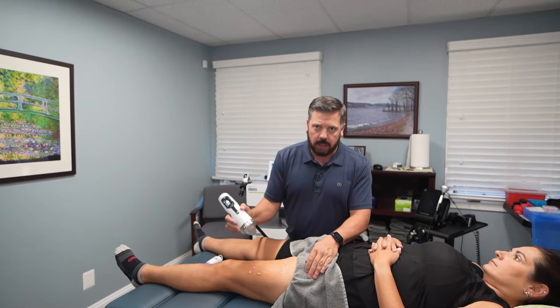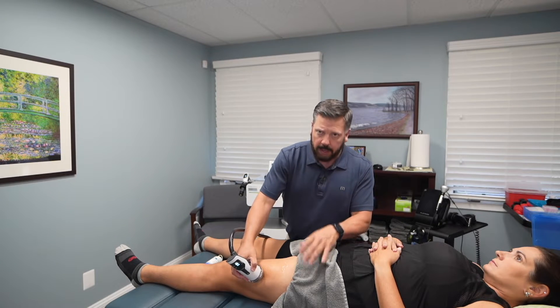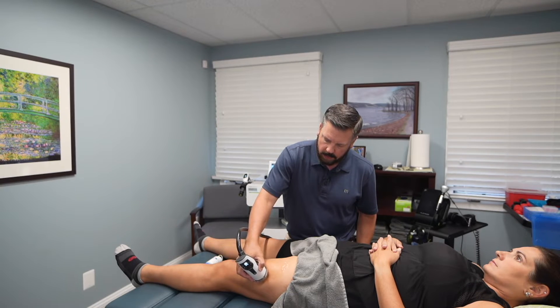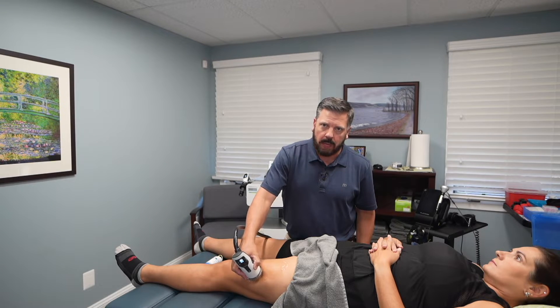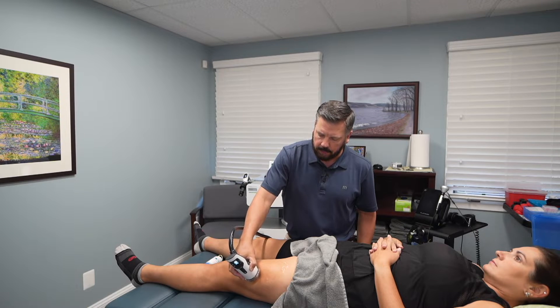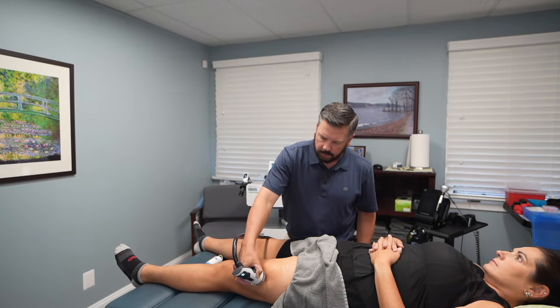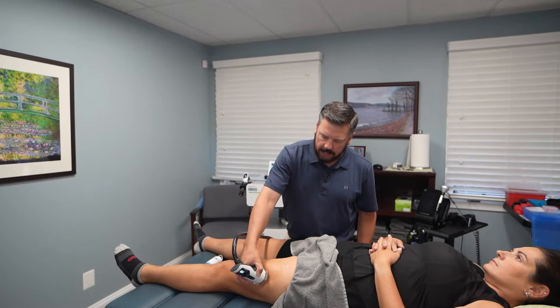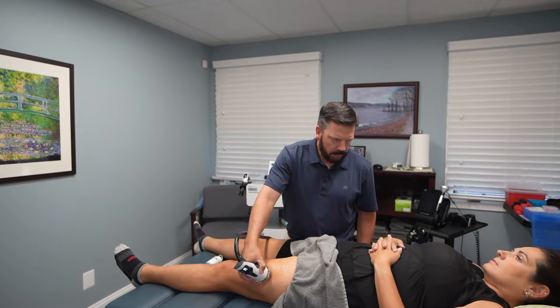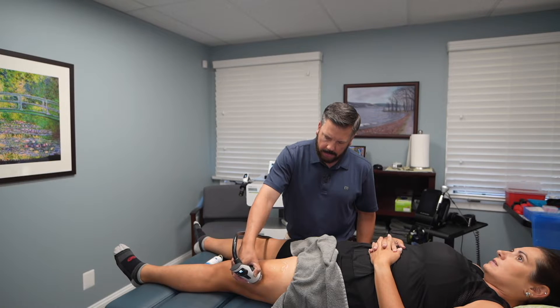We're going to turn this on — you'll also notice it's a lot quieter than the radial treatment, but it will go much deeper. She'll feel a deep, dull, intense discomfort. Over four to five weeks of treatment it becomes less and less achy and then goes away and heals up completely. As I'm scanning the tissue, I want her to let me know where she feels any of that deep, dull ache.